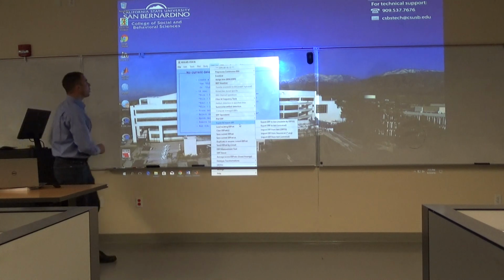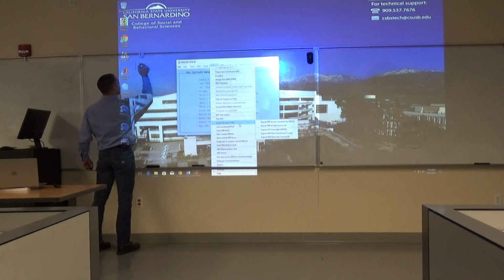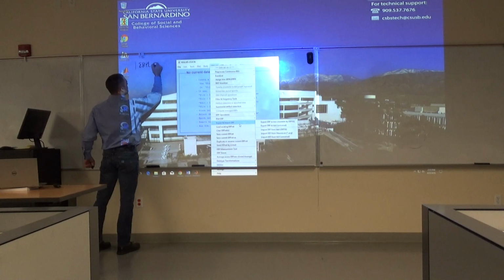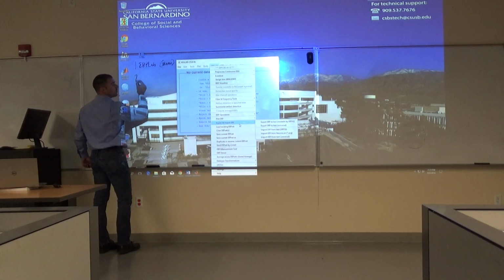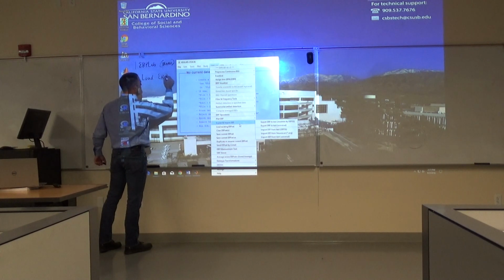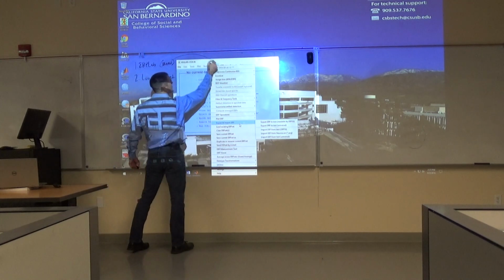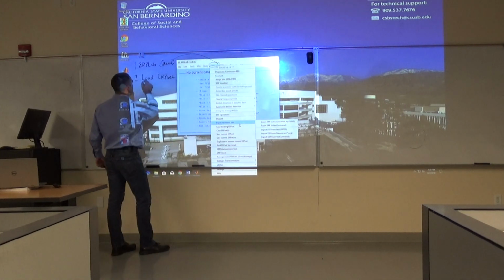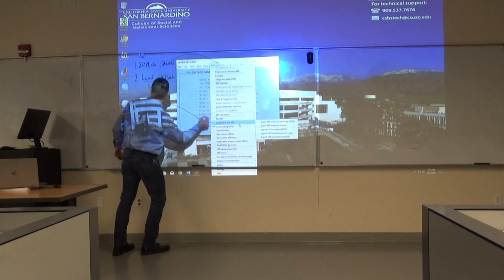So 1, ERP Lab, that's on the menu. 2 is Load ERP Set. Right? So this is there. This is existing.